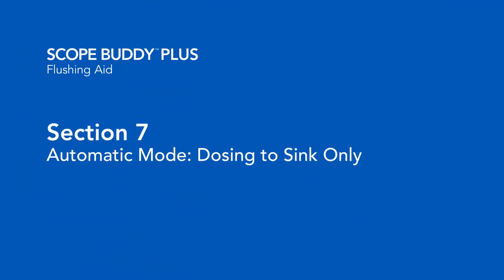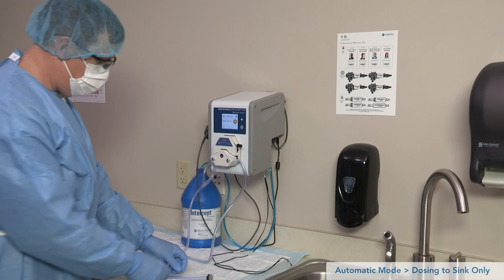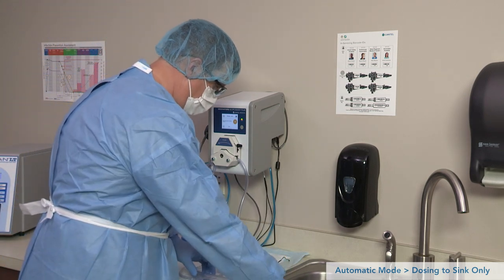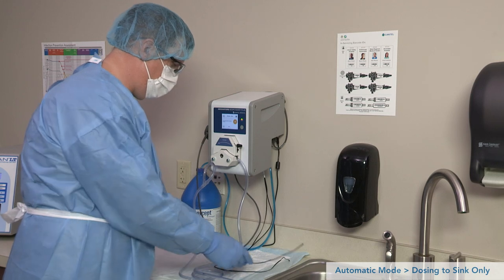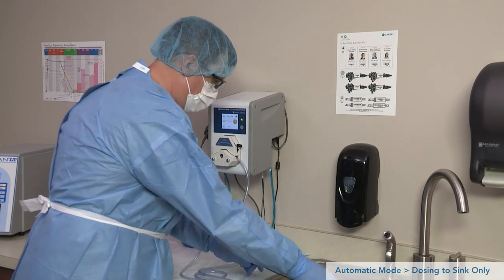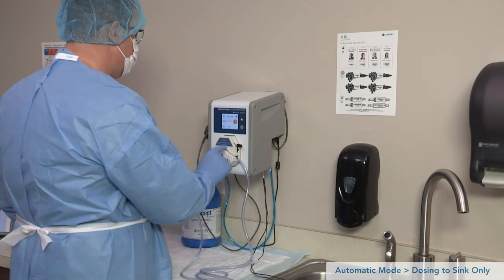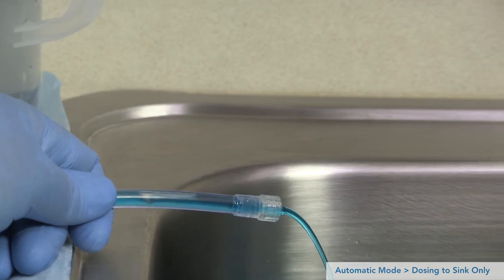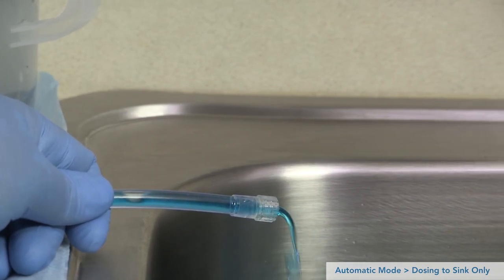Section 7 explains how to dose detergent to only the sink in automatic mode. Ensure both ends of the pump tube are placed into the sink and the sink is filled with the correct volume of water previously entered in first-time setup. Place both temperature sensors into the sink. Press play to begin dosing to the sink. Continue the steps as outlined in Sections 1 through 6, depending on the manufacturer and model of the endoscope.